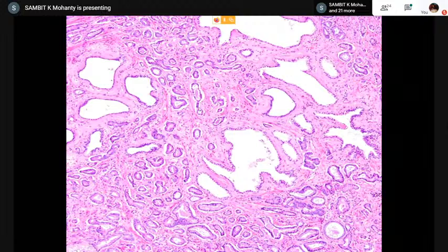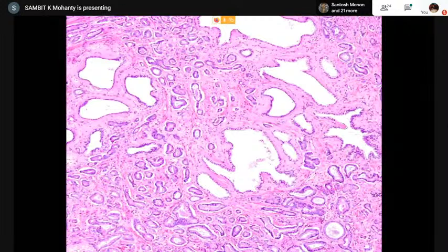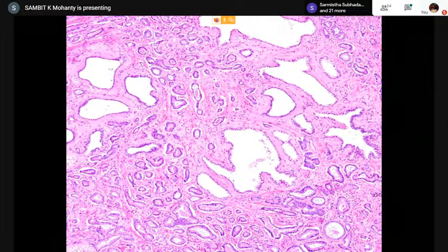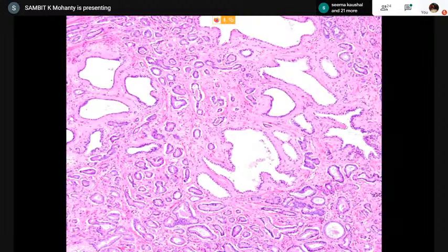So desmoplastic reaction is not usually seen in prostatic adenocarcinoma. That is one thing. Mitotic figures are not readily discernible. Nuclear chromatin is usually opened up. So those are the few features you need to know about prostate. The regular features, hyperchromasia, pleomorphism, nuclear contour irregularity, the nuclear envelope being very irregular, those are not visible in prostate cancer. They are very, very monotonous and monomorphic.